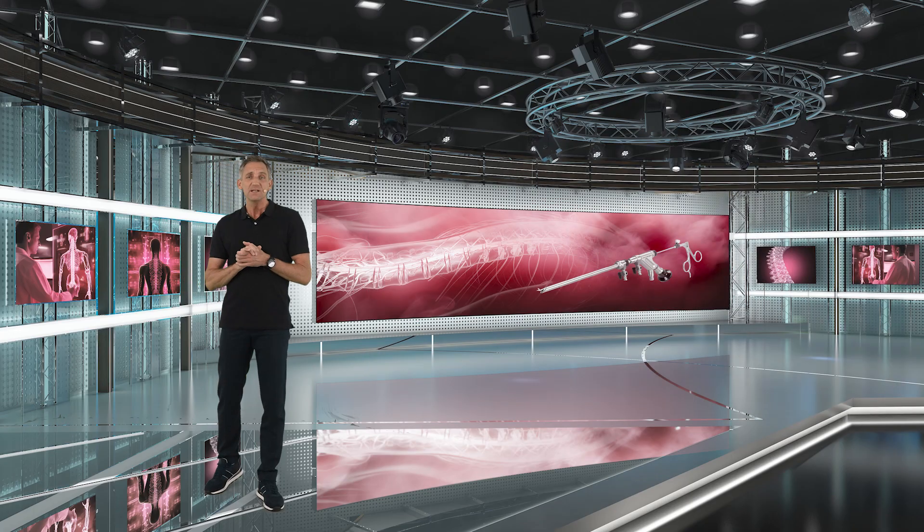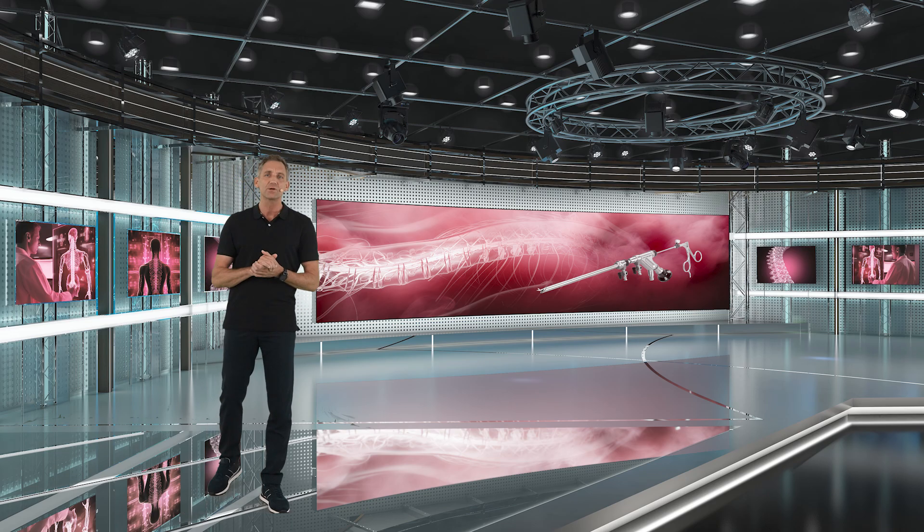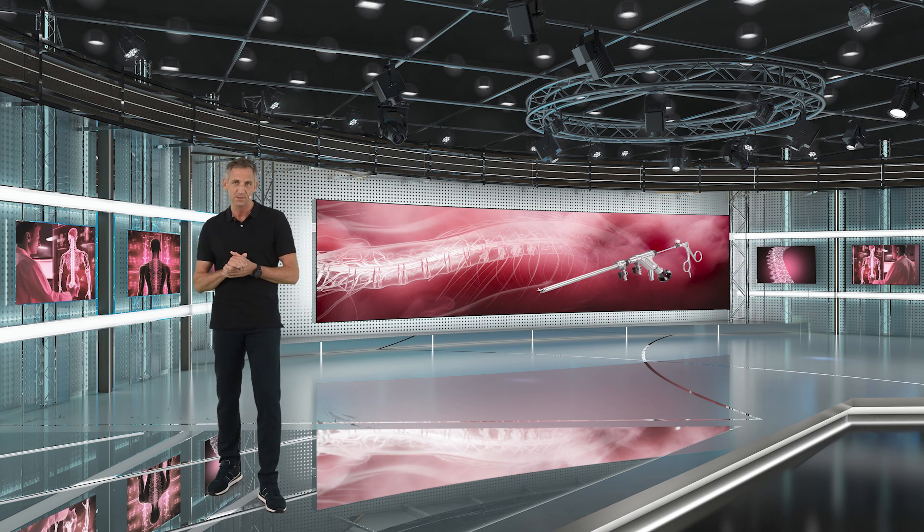Please make sure that you have identified the nerve root safely before continuing your discectomy or sequestrectomy.